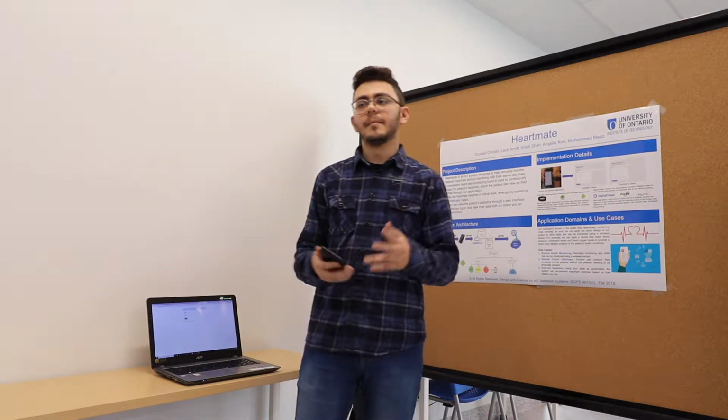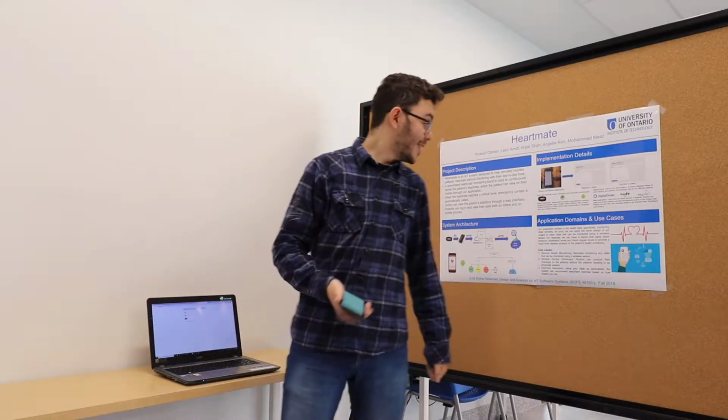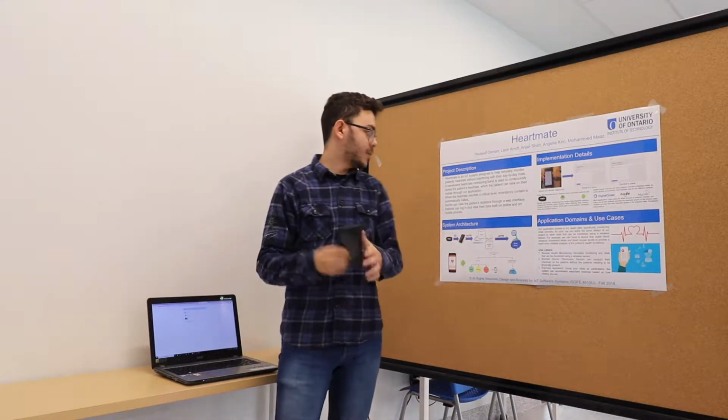There's also an exercise mode, because you know how when you're exercising, your heart rate is naturally going to be really high. So we didn't want to make you contact emergency, let's say when you're taking a run or something. So that's the mobile application part.